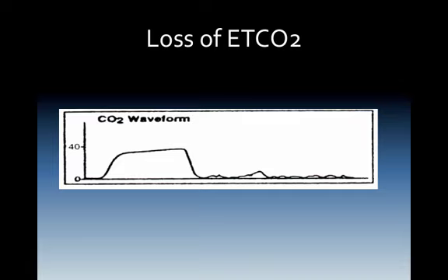Low levels really rapidly could mean total obstruction from a mucus plug. Mucus plugging that would be partial, if you started to see it stair-step down, which we'll talk about here in a little while, over time, they may have a partial mucus plugging. Capnography malfunction. Now, if there's vomit that entered into the side sampling or entered into the area, and all of a sudden the machine cannot see the gas sample. So a lot of things can cause this.